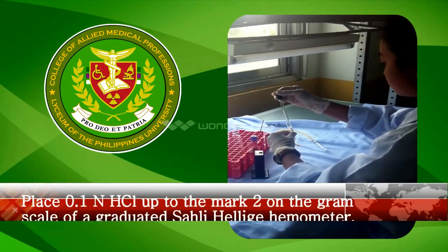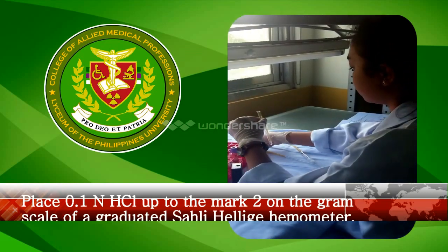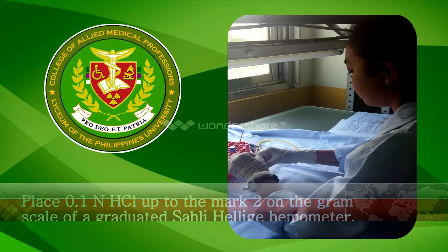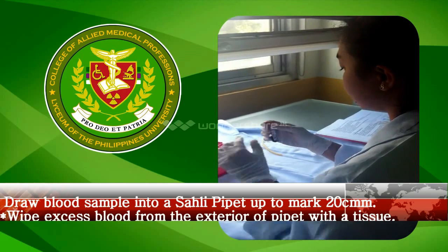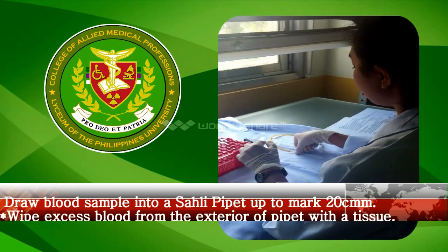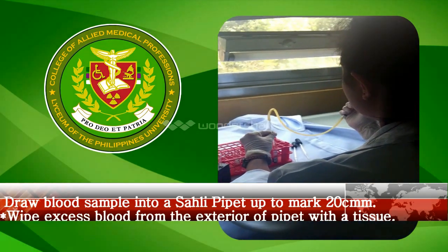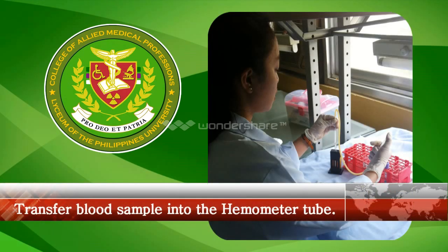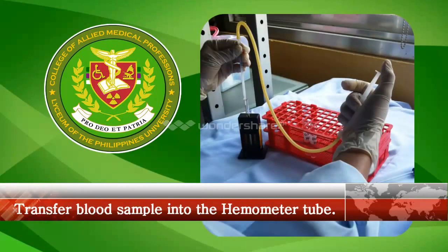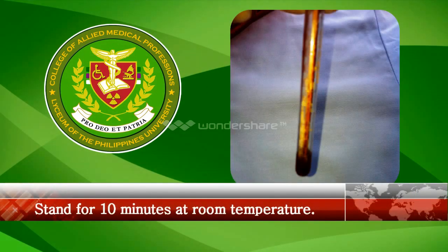First, place 0.1 normal hydrochloric acid up to Mark 2 on the gram scale of a graduated Sahli hemoglobinometer tube. Draw a blood sample, either capillary or venous, into a Sahli pipette up to Mark 20 cmm. Wipe excess blood from the exterior of the pipette with tissue. Transfer the blood sample into the hemometer tube containing the acid and rinse the pipette at least 3 times. Stand for 10 minutes at room temperature.